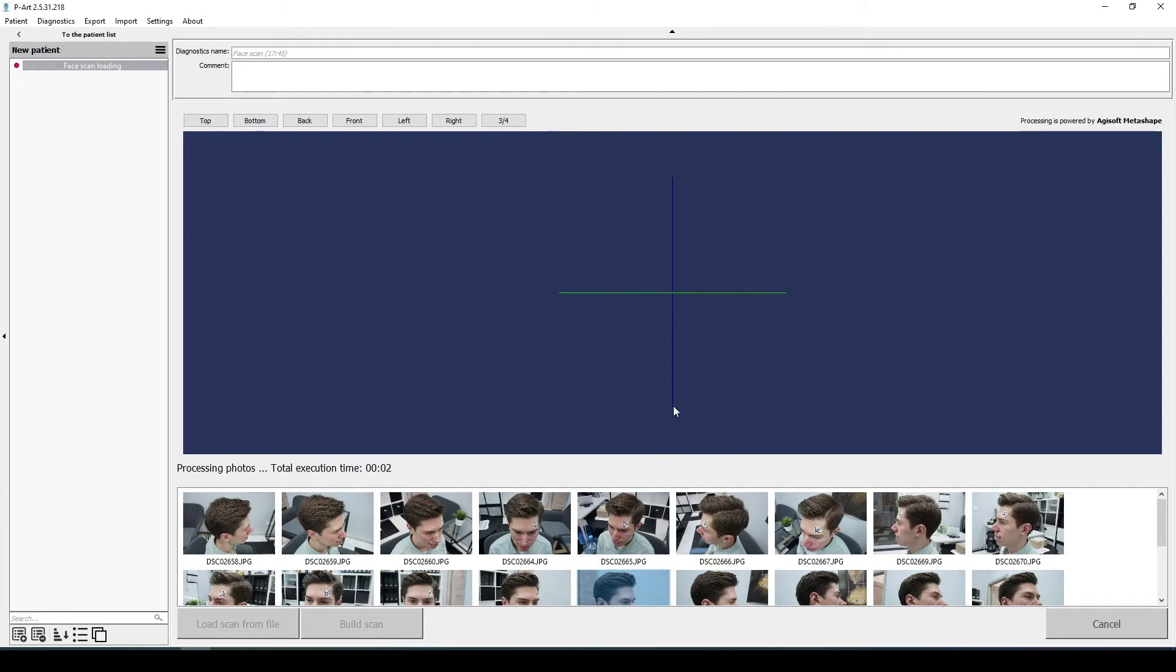Upload the photos, activate the button, build scan, and next, the construction of the face scan will be started.